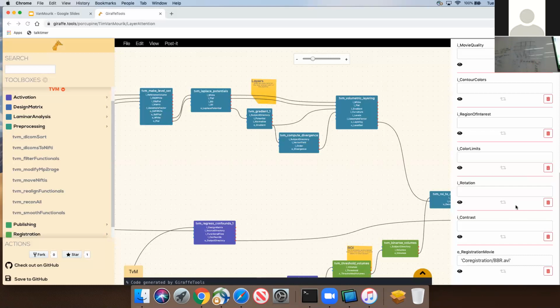Now, there are a couple of issues here. First one, it is quite something to actually be able to set this up. Well, I don't think I'm going to go into great detail, but basically, the Weiner paper, from the Leipzig group, described a method in which you can do this relatively easily.